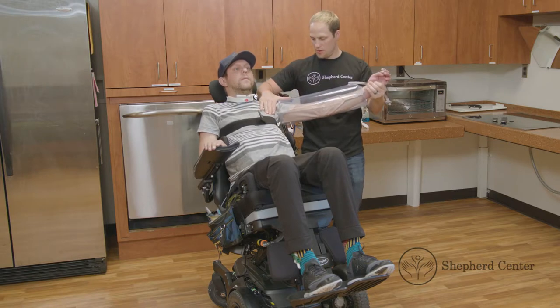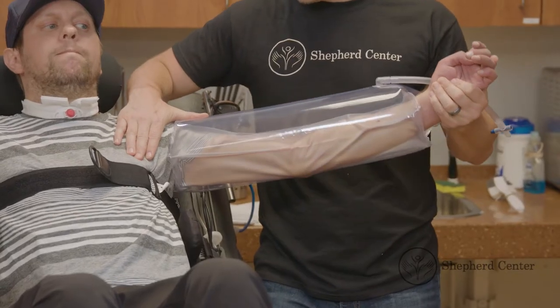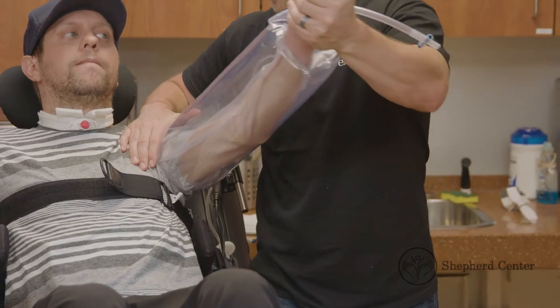Put on the air splint and raise the arm to chest height out to the side. Provide assistance at wrist and shoulder. Bring the arm to the middle of the chest.